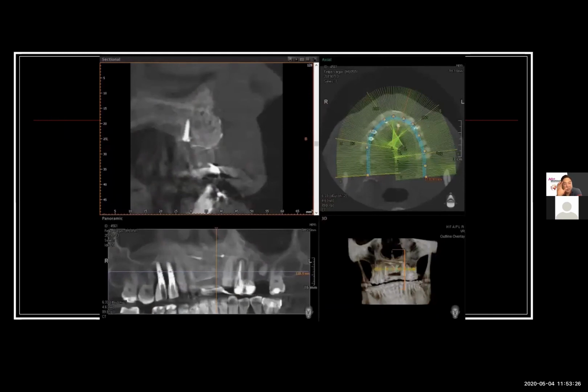And I do want to say I think it was part of just the technology with PRF and the growth factors for stimulating healing and so forth, and also with medication, proper pain control. We did put him on some steroids, a Medrol dose pack, to account for the amount of swelling that was to be expected. Here's our CBCT.